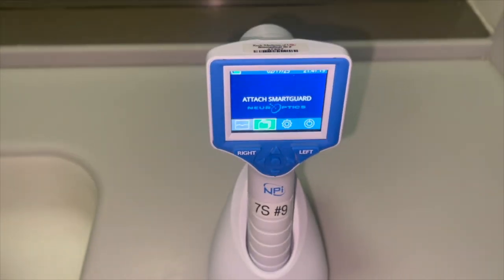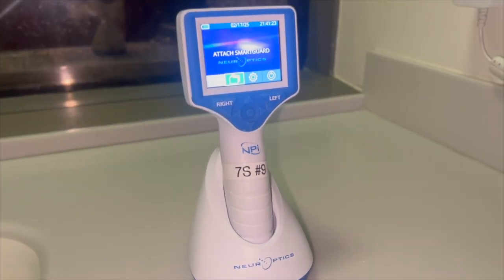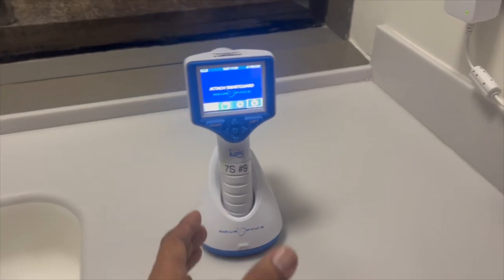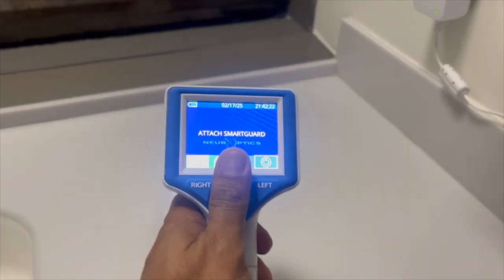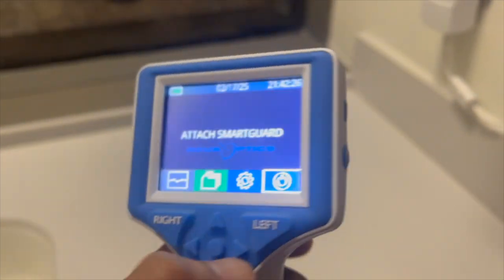First, obtain a Pupilometer from the charging station. You will know the device is fully charged by a green indicator light on the charging station, or is actively charging if there is a blue indicator light on the charging station. The device will wake up automatically when removed from the charging dock.